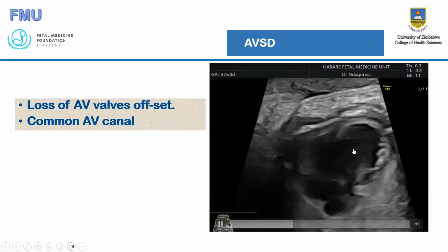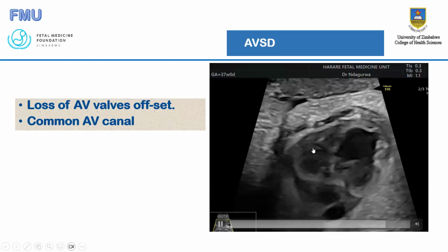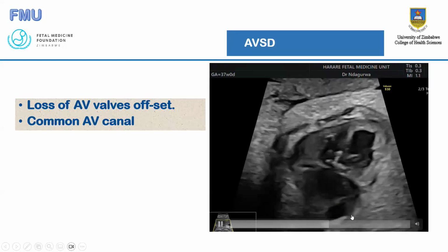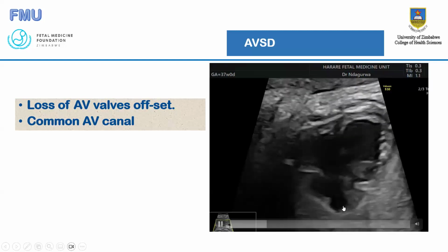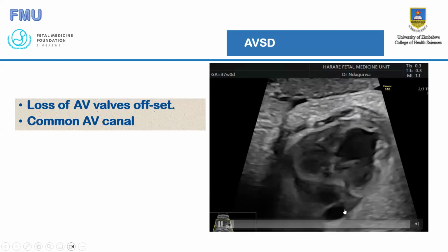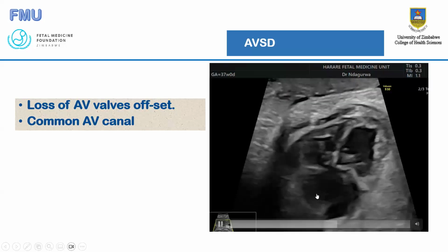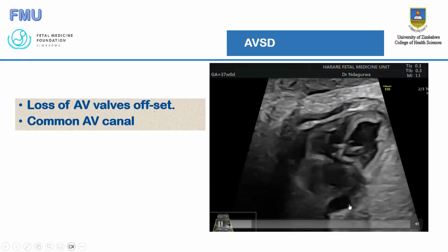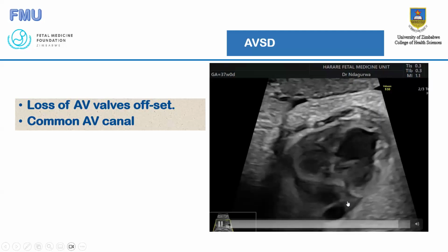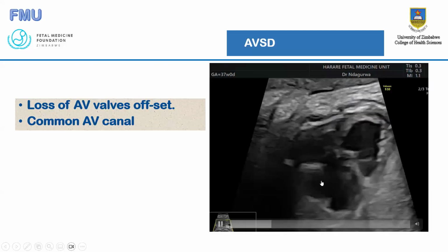And there is also asymmetry of the ventricles. It's quite clear that the left appears to be bigger than the right here. And we are not seeing the pulmonary veins clearly. If we don't see them, it could be just a duplication of the left atria, which we normally see in cases of left isomerism, with duplication of the 2 left atria there.